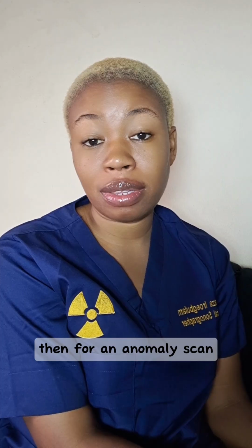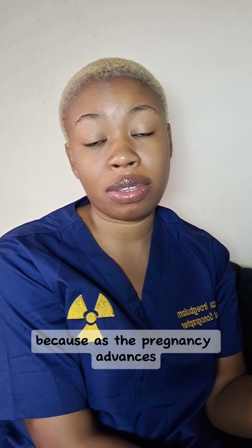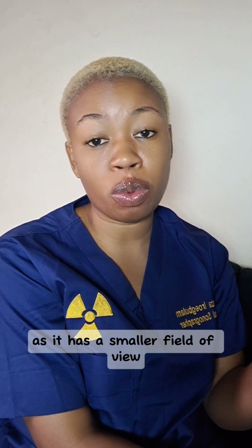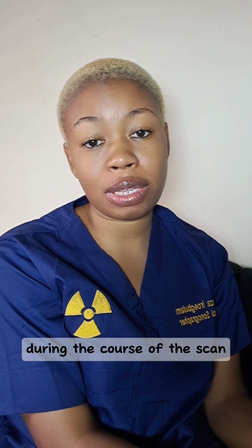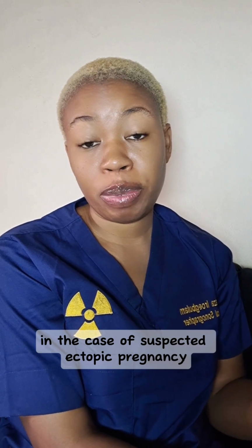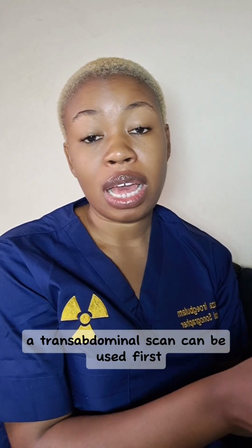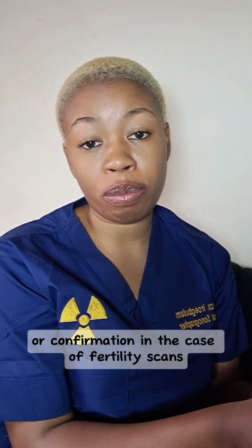Then for an anomaly scan, a transabdominal scan is obviously better, because as the pregnancy advances, a transvaginal scan is no longer required as it has a smaller field of view and will not give detailed information during the course of the scan. In the case of suspected ectopic pregnancy, a transabdominal scan can be used first, and then a transvaginal scan can also be used for additional information or confirmation.